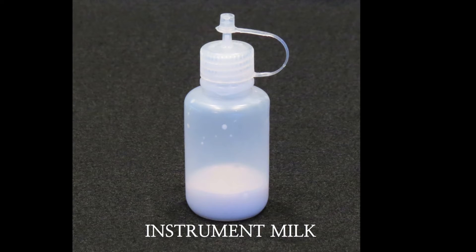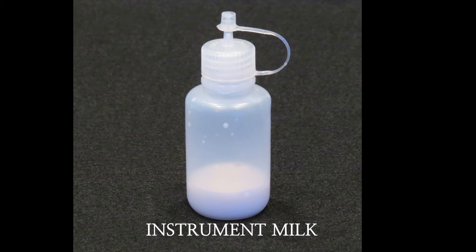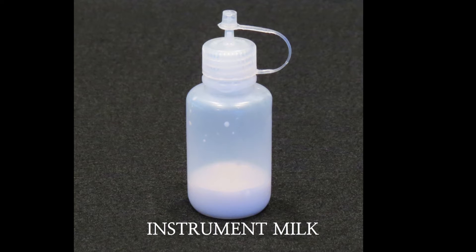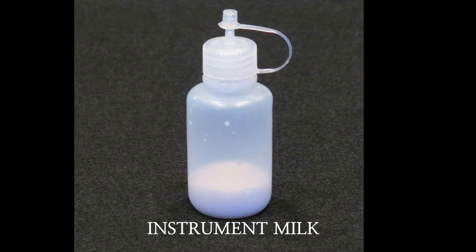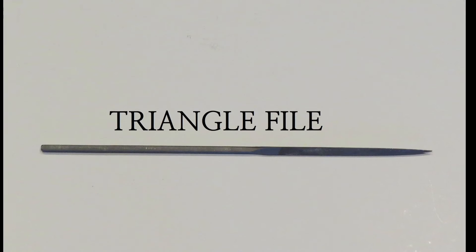Instrument Milk: This lubricant is applied directly to the joints of surgical instruments to loosen sticking or stiff joints. When it is worked into the joint, it acts to dissolve any embedded material that can cause instruments to bind or stick during operation.